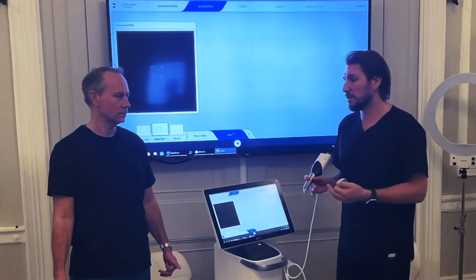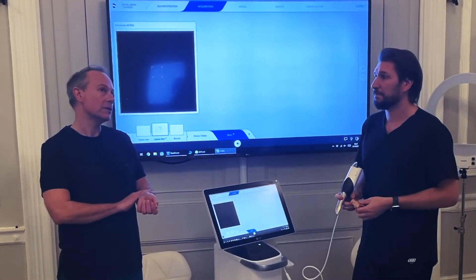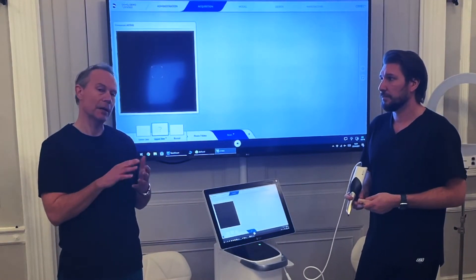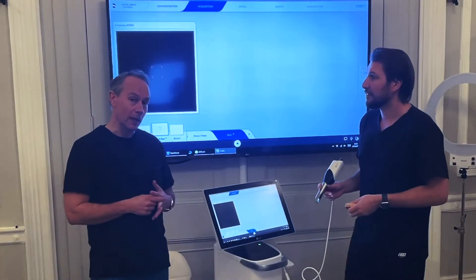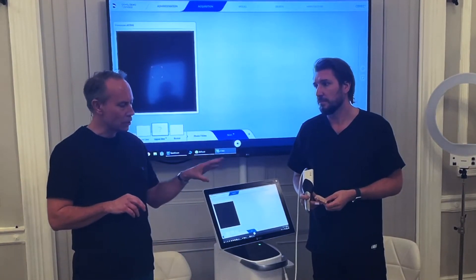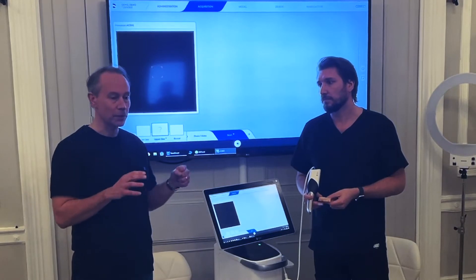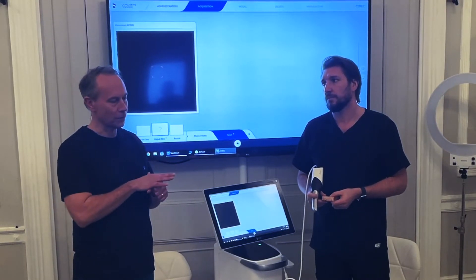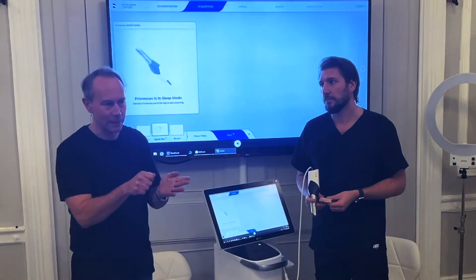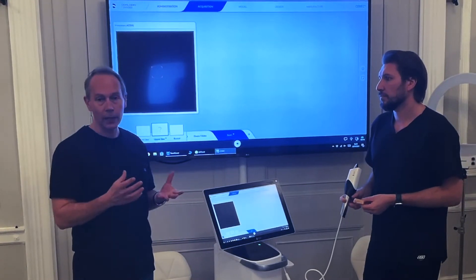Don't go too fast or too slow. Too fast and you'll lose areas and skip over them. Too slow and you create too much data — it takes longer to make a model and can fill your hard drive, cause blurring, or even a crash, especially with the Omnicam. Also, start at a clear reference point like the occlusal of a premolar or molar, because if you scan a bit and lose it, you may struggle to find that area again.